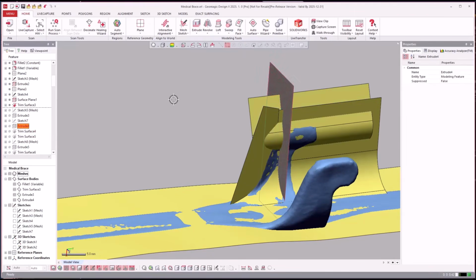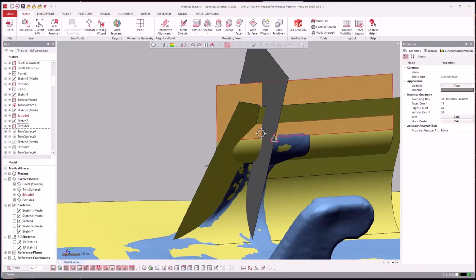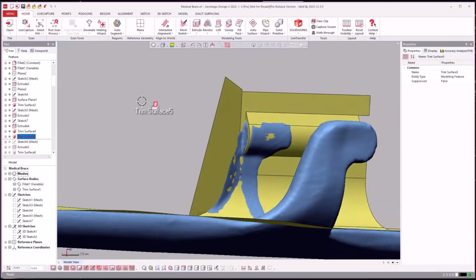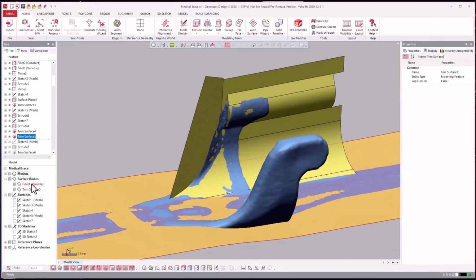We're going to do a couple more extrudes. Extrude this section, and then this part is going to cap it off, and then trim those to each other, and then trim all of that into that surface. So you see here we have that bottom surface and then the side ear there.